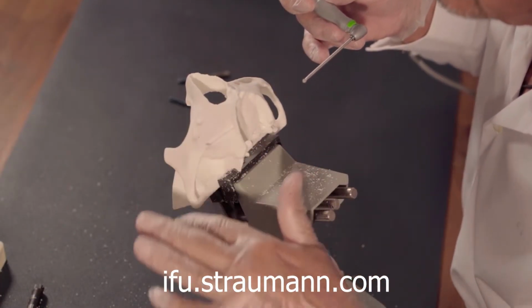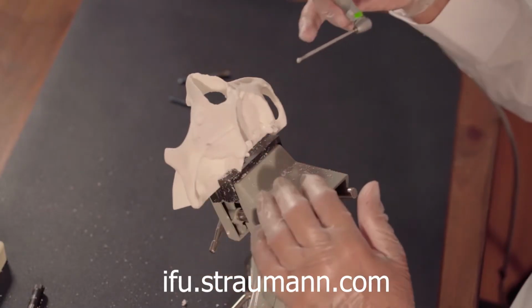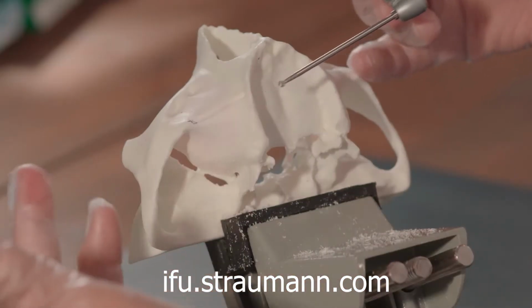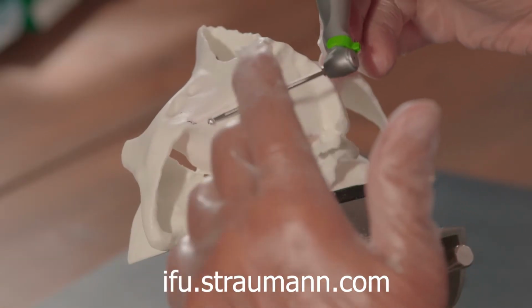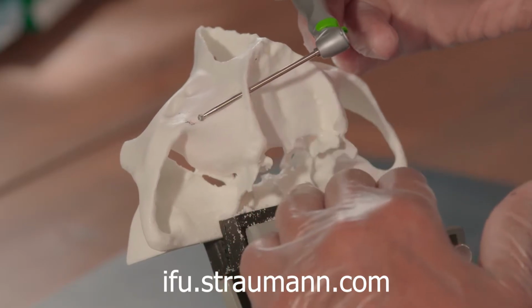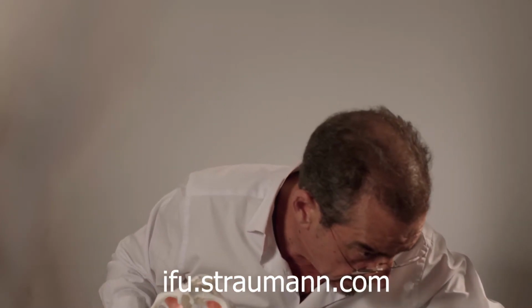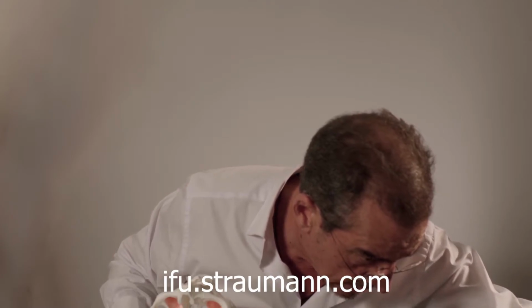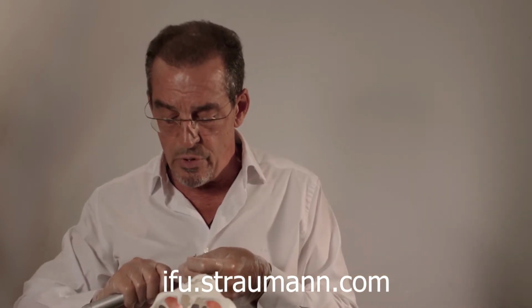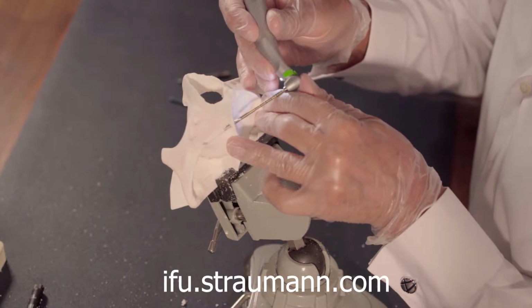So we have a hole, a tunnel here, and then we have not enough bone to have a roof on the tunnel there, but we made a notch on the end. And this notch is intended to stabilize our next drill, which today is going to be a 2.9 drill. But this is a big advantage. We have just two drills.